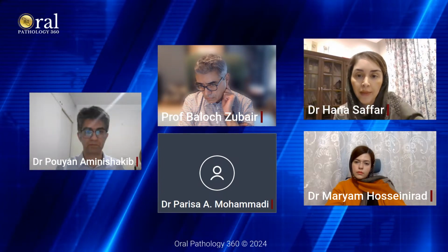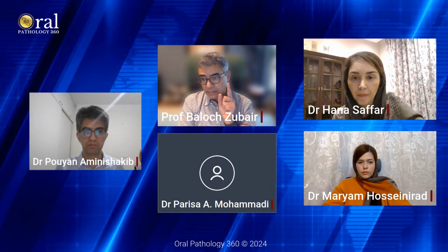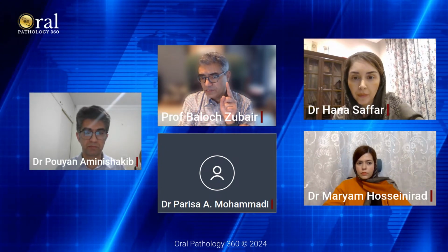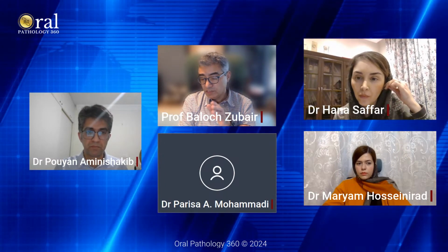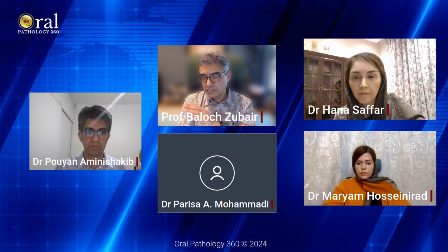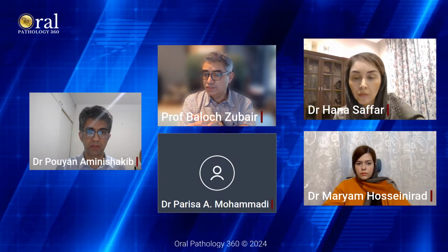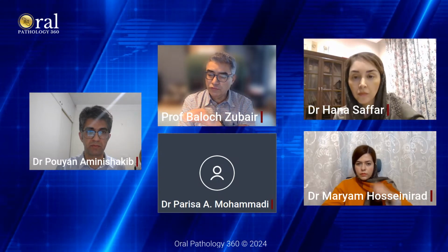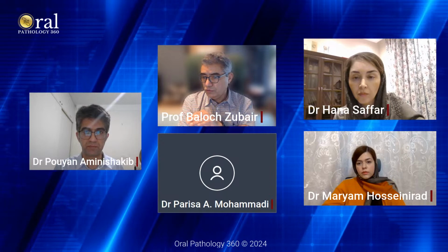to see under microscopic examination. Remember, the biopsy is giving you a sample, so you don't know if there's a high-grade component that is not represented on the biopsy. What I do is, if my differential is acinic cell versus mucoepidermoid versus secretory carcinoma, I always try to get a cell block and do stains, because there are specific stains for them. IHC is really good for NR4A3, but DOG1 I don't like, because it can be positive in a lot of things, and I usually don't do those stains.